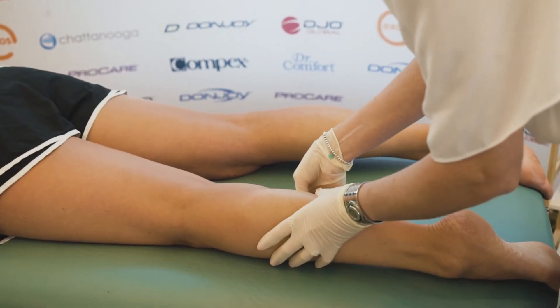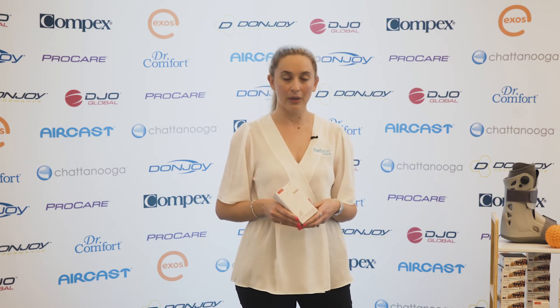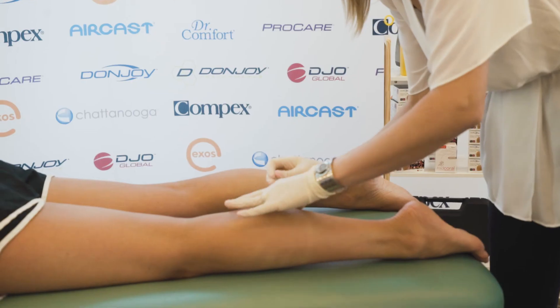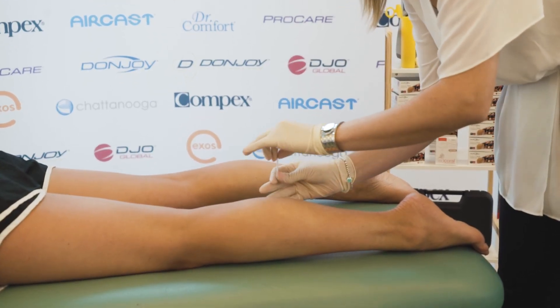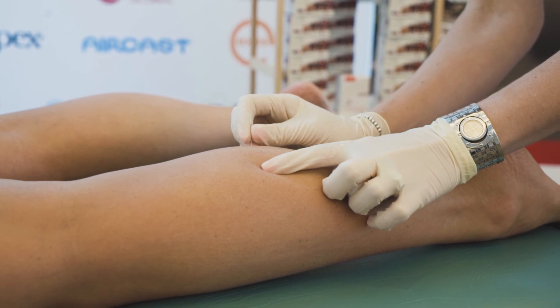Often there is a loss of range of motion. We look for these trigger points by palpating and pressing on the calf muscles, and once we have found them we select the right filament. We wipe down the patient with antiseptic and then we insert the filament quickly and rather painlessly. There are a few techniques that can be applied once the filament has been inserted, and this will depend on your practitioner and the treatment that you require.